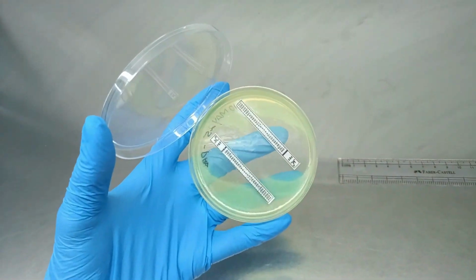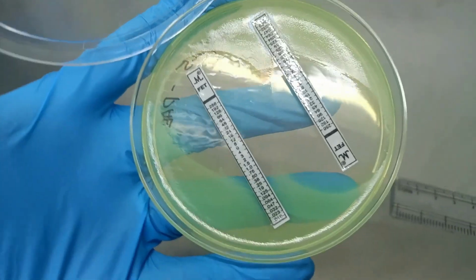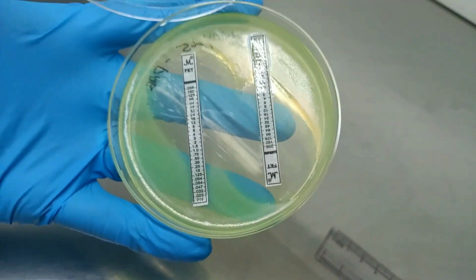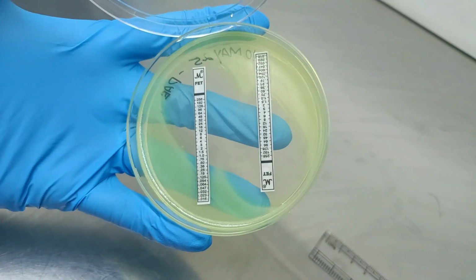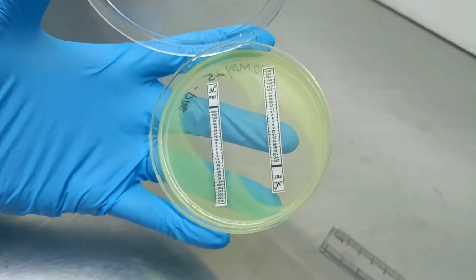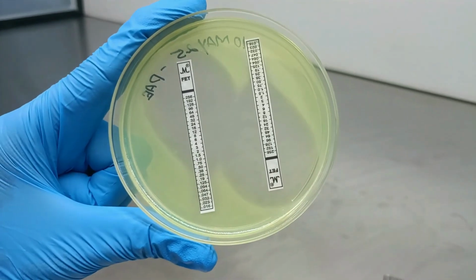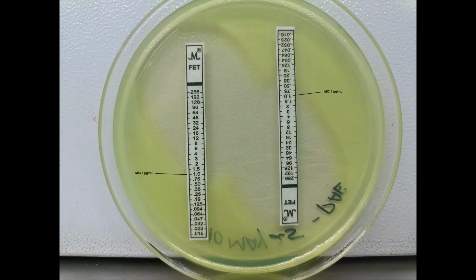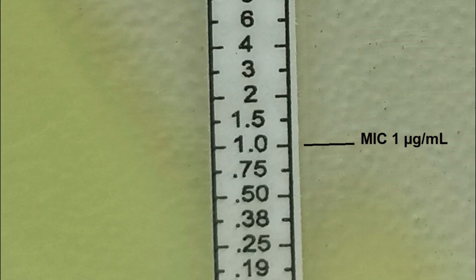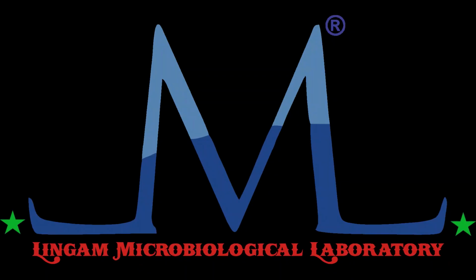If the ellipse intersects between two values or is asymmetric, showing different values on each side, read the higher concentration as the MIC. However, if the discrepancy exceeds one doubling dilution factor, repeat the test for accuracy. Interpret the MIC result using recognized standards such as CLSI, EUCAST, or local guidelines, and classify the organism as susceptible, intermediate, or resistant.